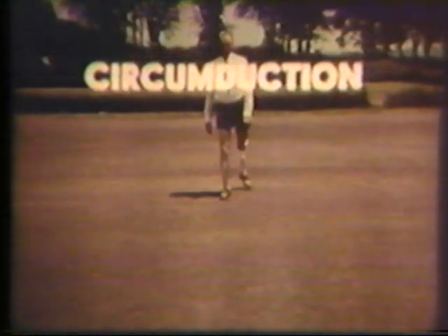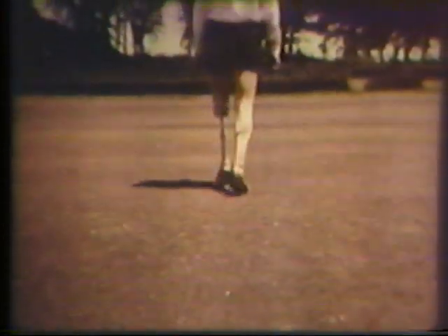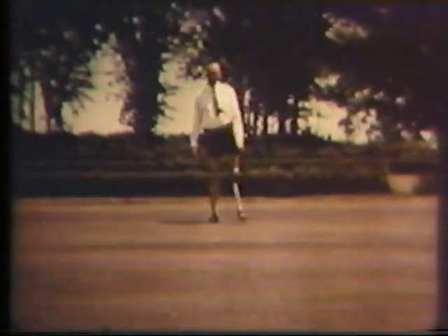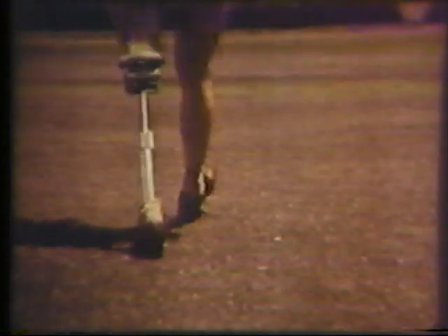The circumducted gait is characterized by a wide swing laterally by the prosthesis during the swing phase of gait. It is important to note, however, that during the stance phase the foot returns to a normal position on the supporting surface. This is the key point in differentiating the circumducted gait from the abducted gait. This is a very tiring and very slow gait because of the delay necessary for the prosthesis to complete the additional movement through the lateral arc.